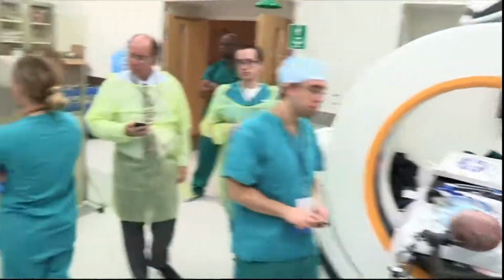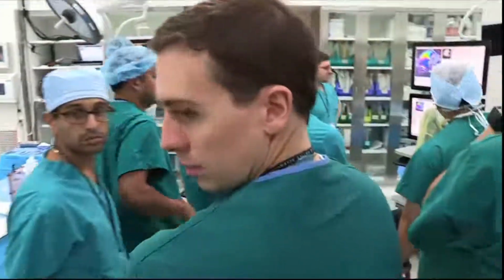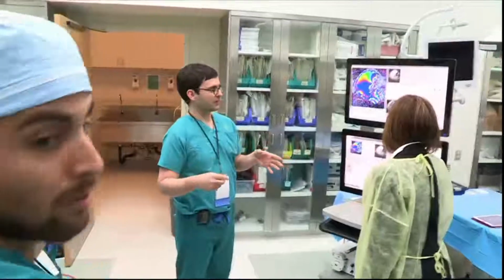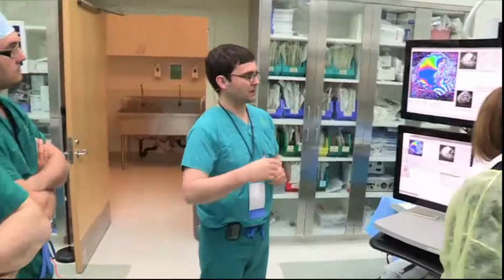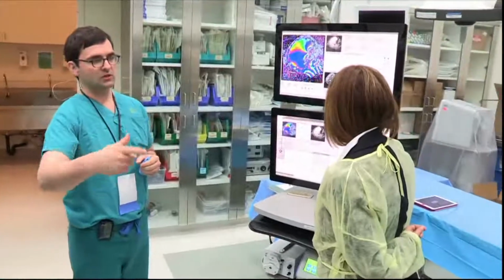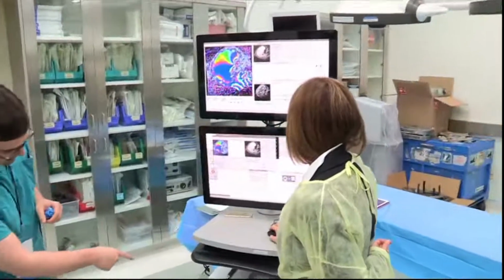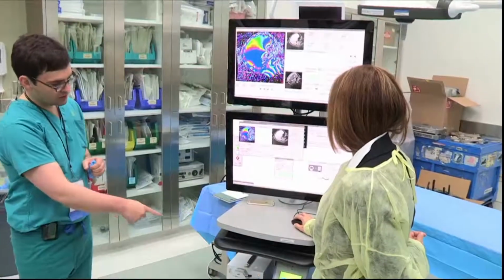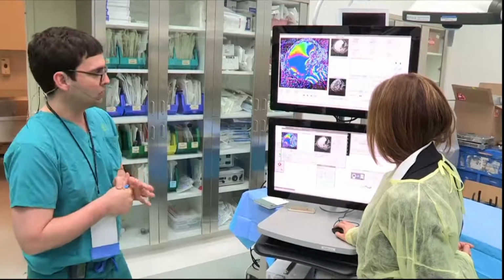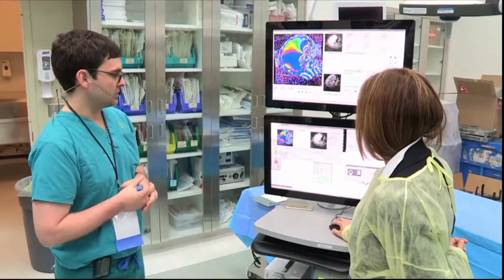So, once you have the patient in the MRI scanner, the anesthesiologist will be securing everything. When you put the coil on, you want to be mindful of the catheter again. You don't want to bend it. You don't want it to be making any sharp turns at all, because basically that irrigation needs to be going the whole time, and you're going to have that as part of the setup here. So you're going to start the irrigation, and you're going to make sure that's getting good coolant of the laser.